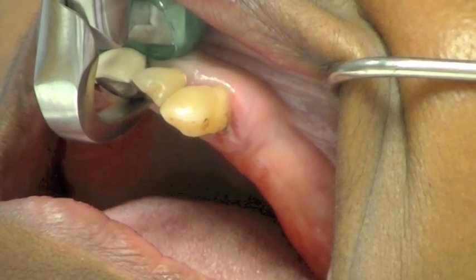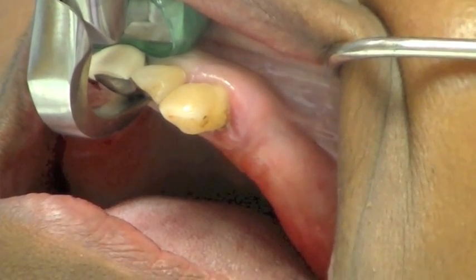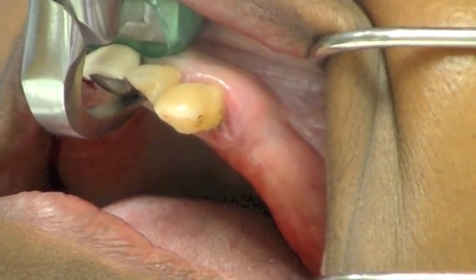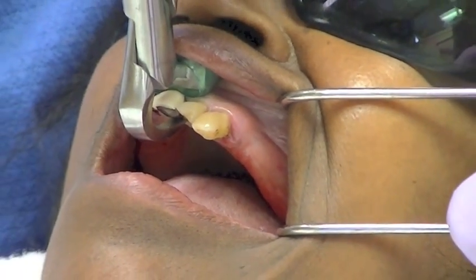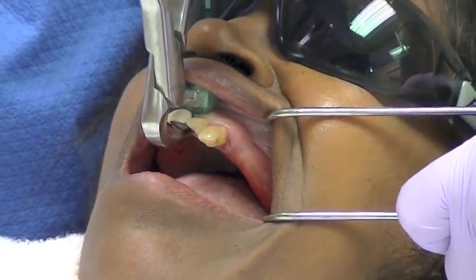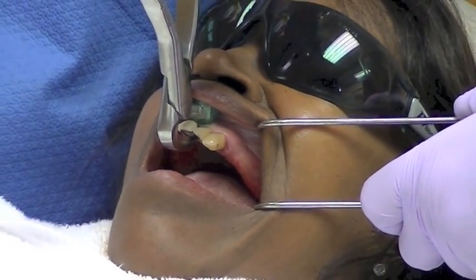In this case, the patient's maxillary or upper teeth were removed. For purposes of demonstration, we will demonstrate the use of the physics forceps in extracting three upper anterior teeth.